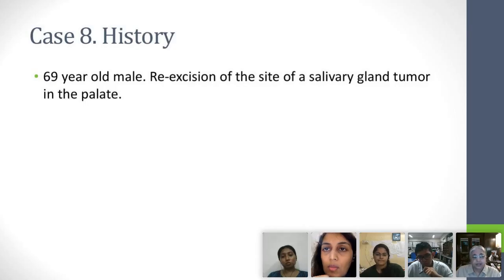Anybody else? Yes, carry on. There is a suspicion of malignancy or reappearance. So you think the surgeon thinks that there is a recurrence. Anybody else? Neha? Neelam, okay. Ma'am, it would show that there is a history of surgical intervention, and whether the lesion is the same or not, that we can't say. That's what they want to do.